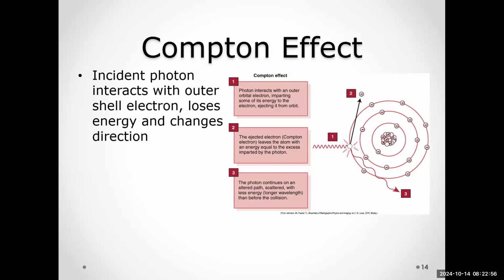I believe today is also when we're going to do an activity in lab to demonstrate scatter and how the body is the main producer of the scatter. Now, scatter can be created in the table, or if you're directing the, well, we'll talk about that. Never mind, we'll get to that. I don't want to get off track.